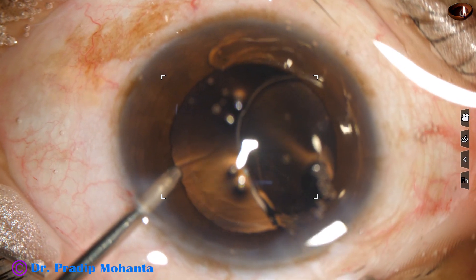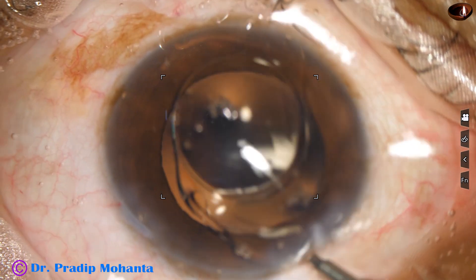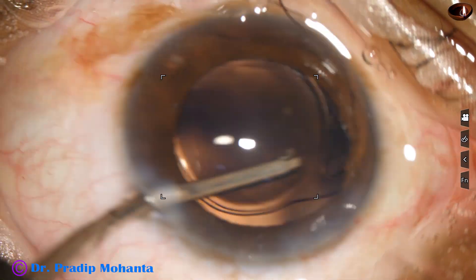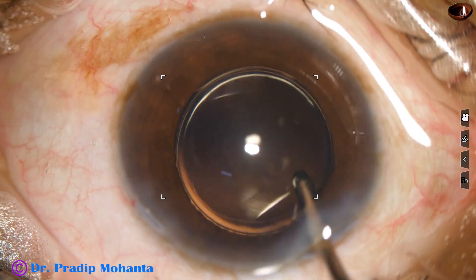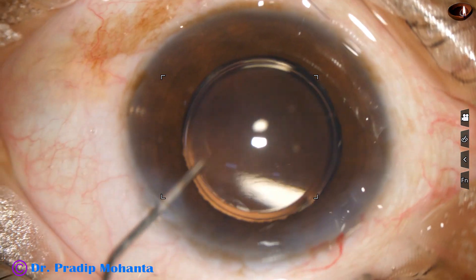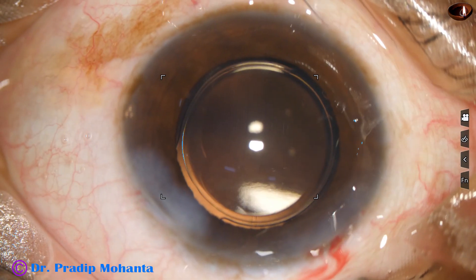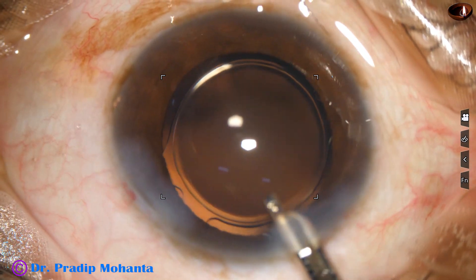In this case the lens didn't go into the capsular bag, so I'm using the irrigating probe to place the trailing haptic first in the capsular bag. Then I go through the side port and place the leading haptic in the capsular bag. Now the lens is in the capsular bag, and you can see that the lens is nicely overlapped all around by the rhexis anterior capsular rim. A thin rim of anterior capsule is overlapping the optic — this is good, as it prevents decentration and tilting of the intraocular lens.